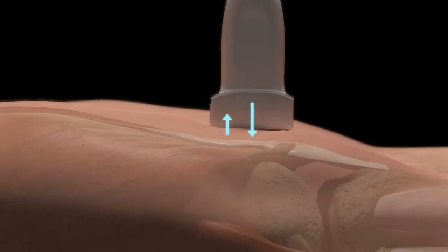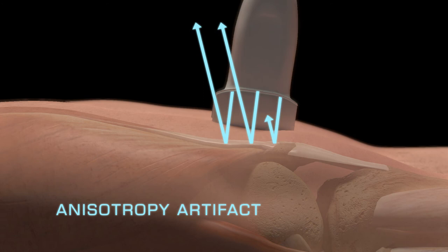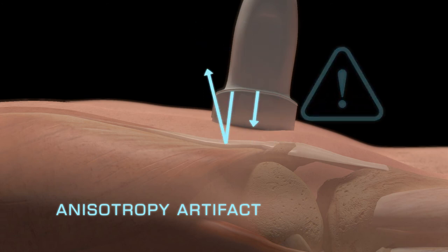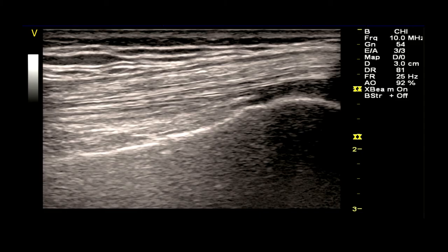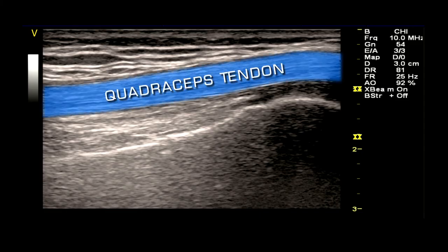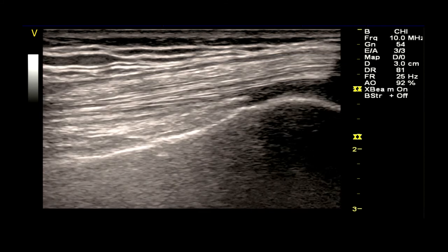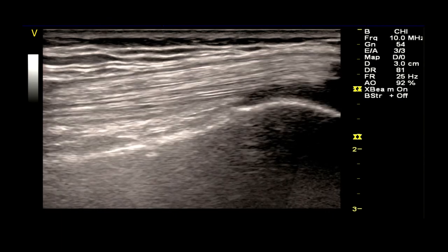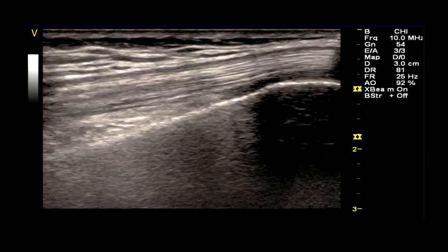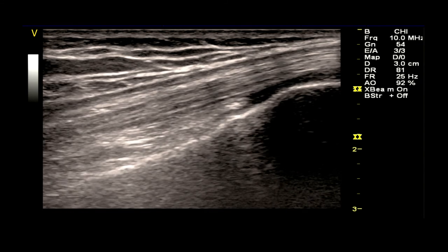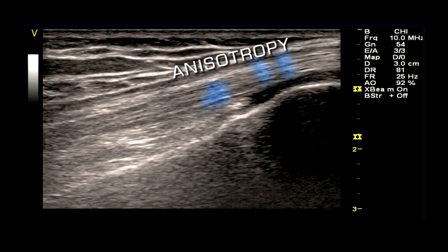The anisotropy artifact is a phenomenon that can occur when the probe is not positioned perpendicular to the tendon being imaged with ultrasound. In this suprapatellar image of the knee, the quadriceps tendon is largely hyperechoic. When the probe is rocked slightly to make the ultrasound beam not perpendicular to the tendon fibrils, hypoechoic or dark areas seem to appear within it. This artifact not only leads to suboptimal imaging, but can lead to errors in interpretation. Hypoechoic areas in the tendon could suggest tendinitis or tendon injury and lead to a misdiagnosis.